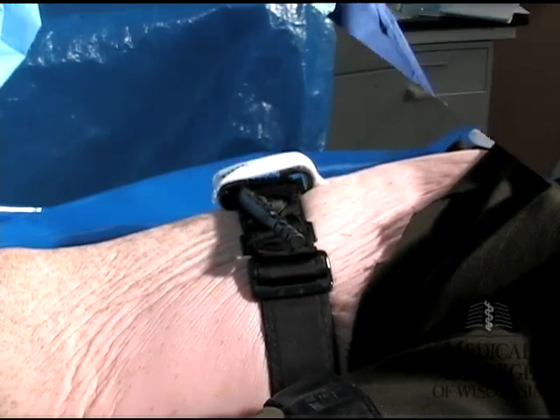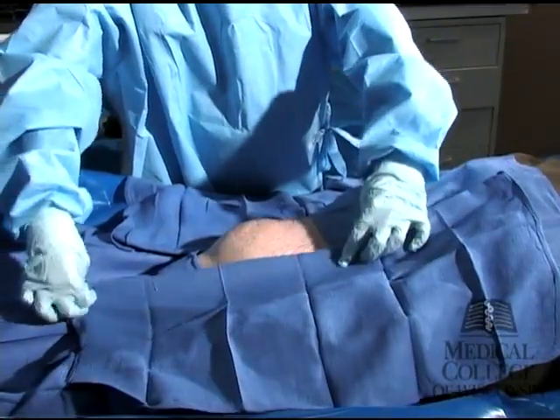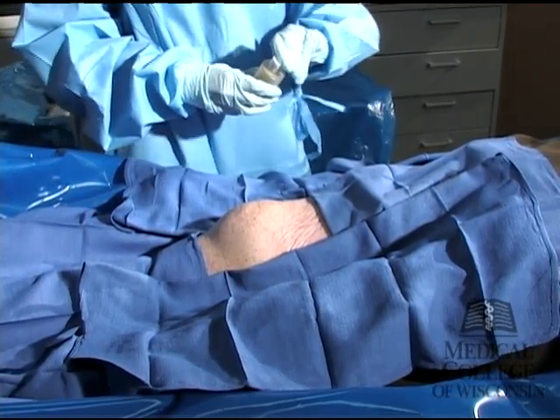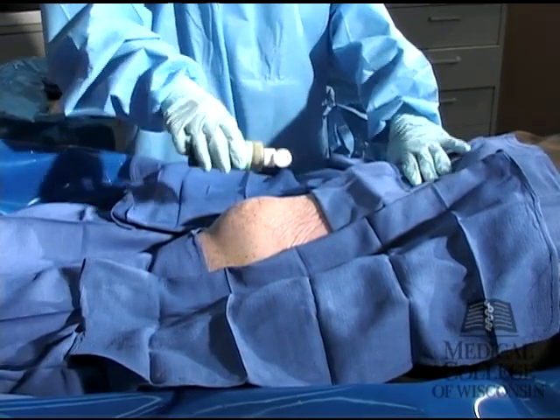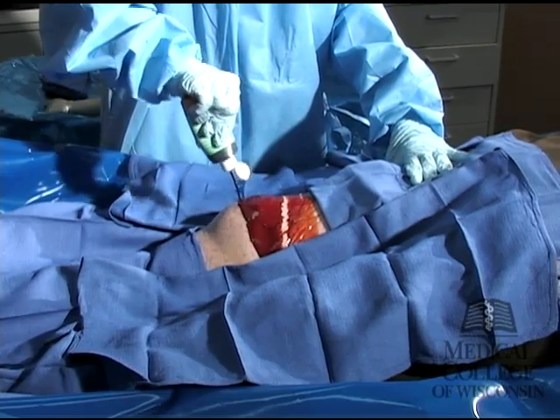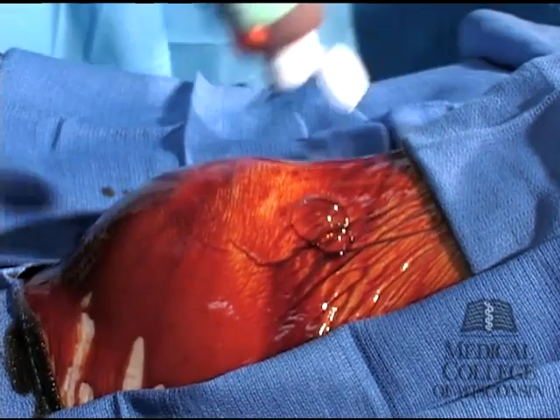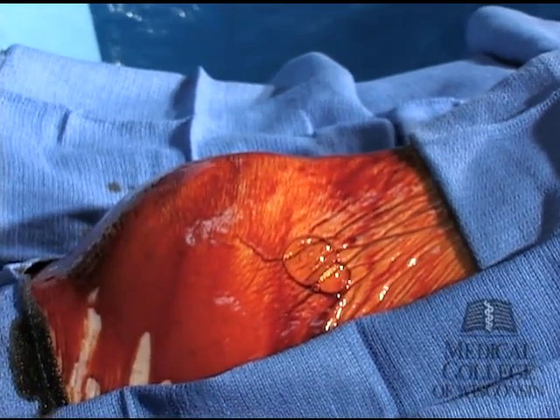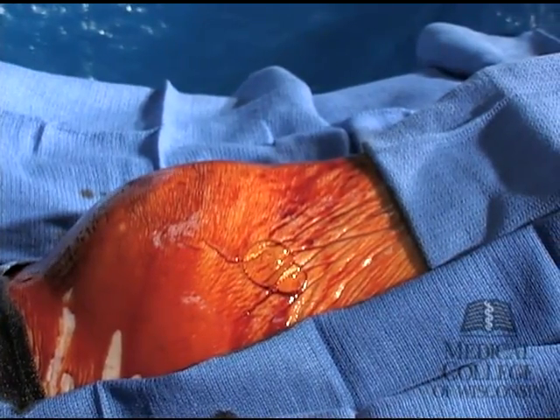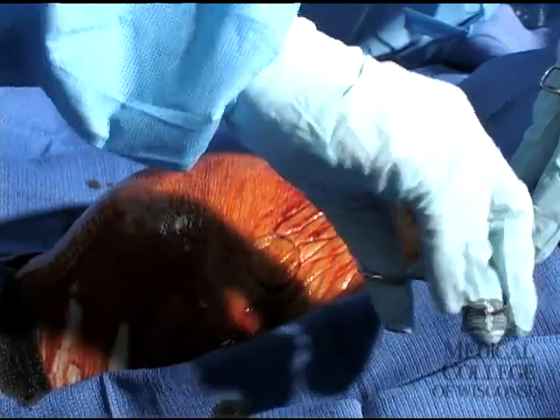Tighten the tourniquet until all visible bleeding has stopped and mark the time the tourniquet was placed. Next, apply sterile towels over the proposed area of amputation. Apply betadine over the area of amputation and allow to dry for 2 minutes. If needed, you can use towel clips to help hold your sterile towels in place.